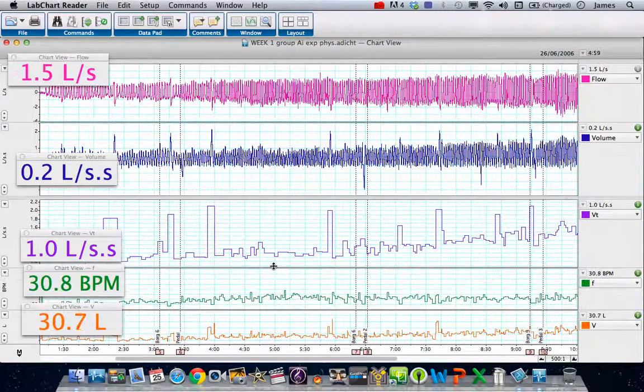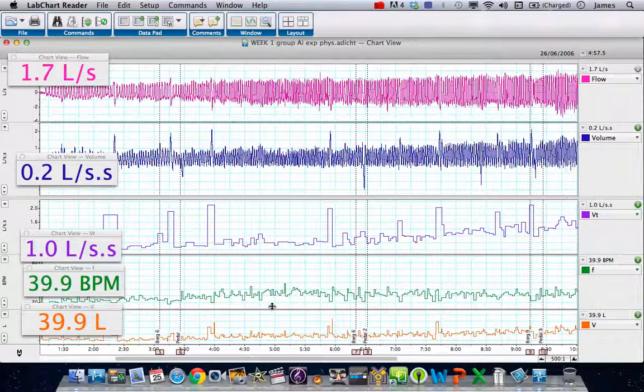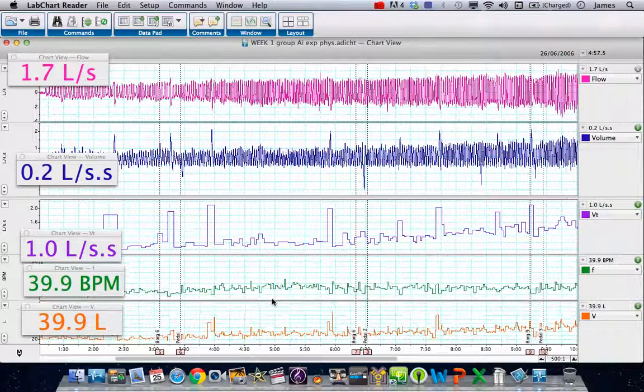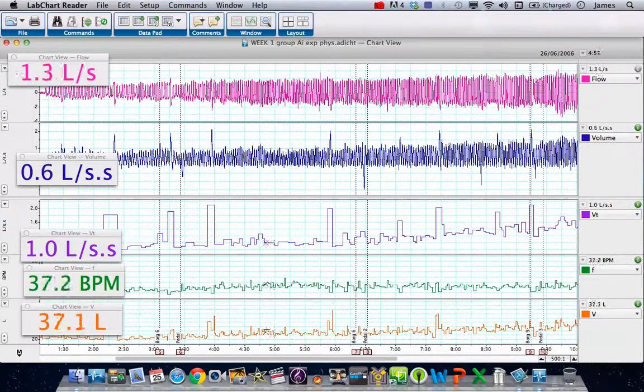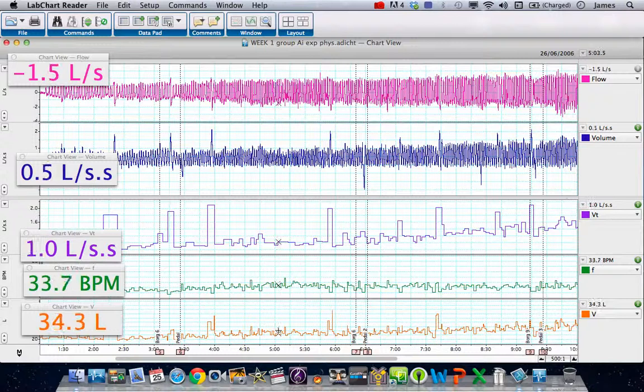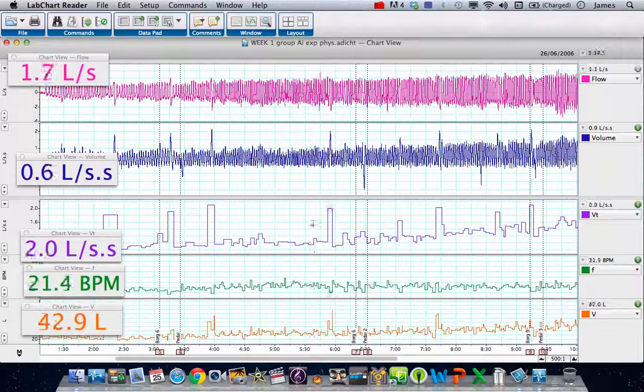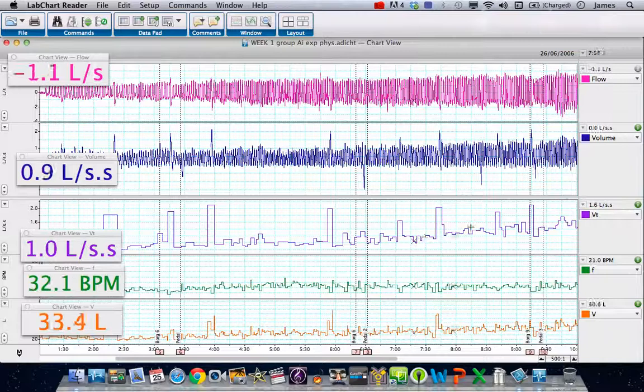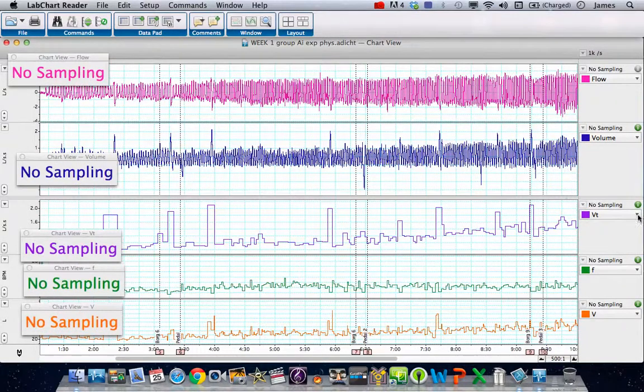The first is our tidal volume, VT, the second is our respiratory rate, F, and the third is an arithmetic calculation which is giving us our minute ventilation, V. So what we've got at the top is VT.